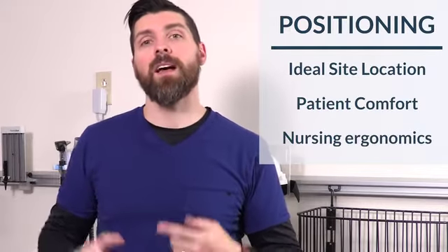The first one is ideal site selection. So what that means is if we're putting in maybe a foot IV, we want to make sure that we put the foot in the best position, the most proper position, and the most optimal position to get that IV started. If I raise that foot up really high, it's actually going to cause that venous draining, so the veins are going to be flat, they're not going to pop up like you want them to, it's going to make it more complicated. It also is uncomfortable for the patient, so always take that into consideration.